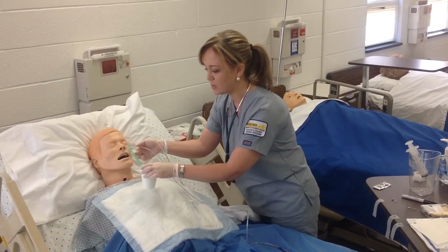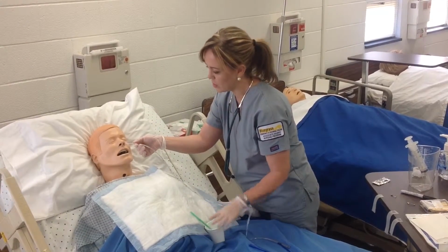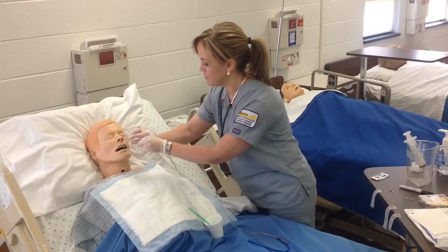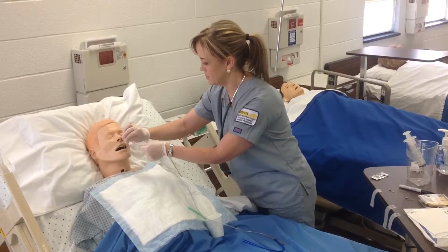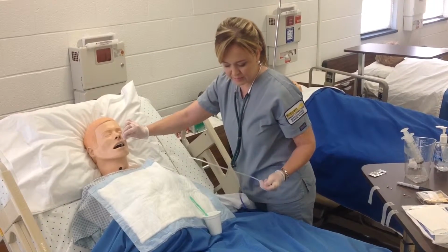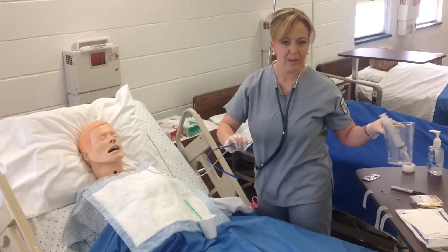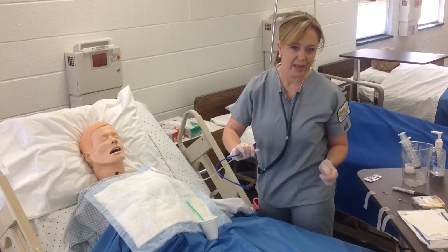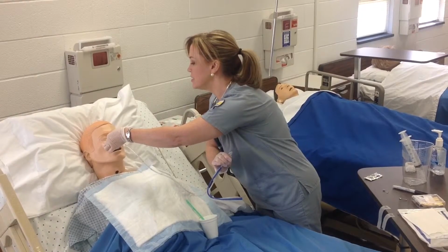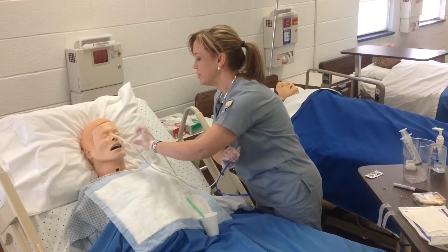At this point, I'm going to have him move his chin forward and take drinks of water while we continue to insert the tube, because drinking the water helps the tube to go down. Okay. Okay. And that's where our tube generally stops. I am going to clamp off the end of the tube, and I'm going to secure the tube to his nose. I'm going to ask him if he's doing okay. Observe his respiratory rate to make sure there's no breathing distress.